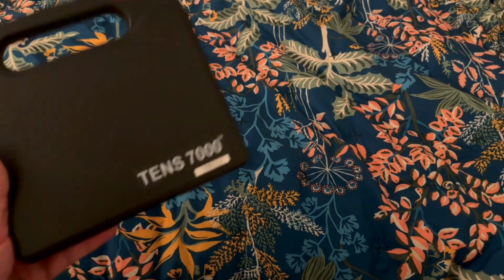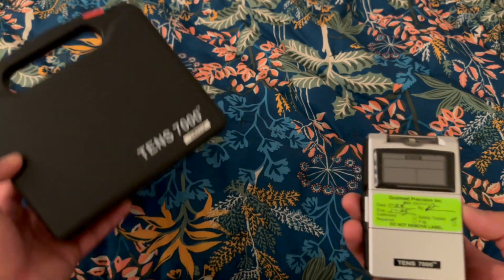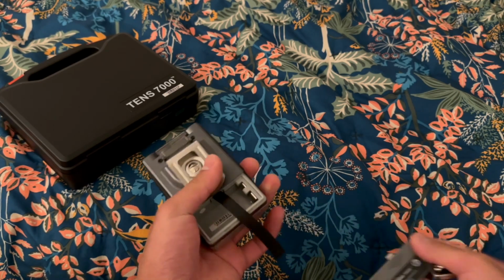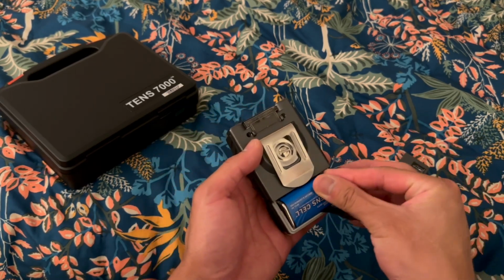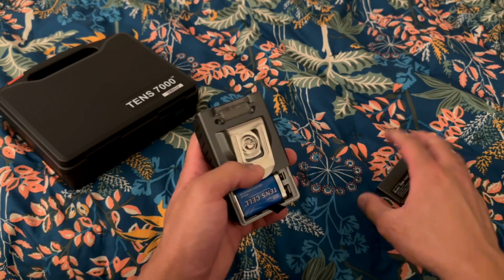So let's go ahead and show y'all how we set up this TENS 7000 device with the parameters, explaining each little bit of it, and then we're going to do a brief example on myself to address my shoulder pain today. So here's our TENS box that we got our unit inside of, obviously taken out, and it also comes with a battery. We'll remove this back plate and then just place the battery right over that black ribbon so we can pull it out whenever we need to, nice and easy.